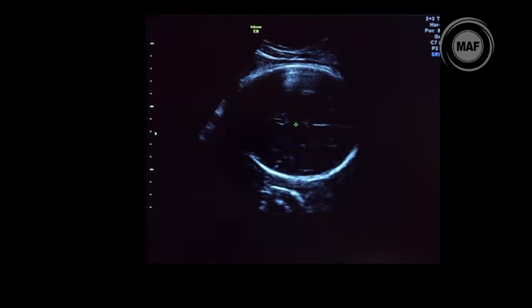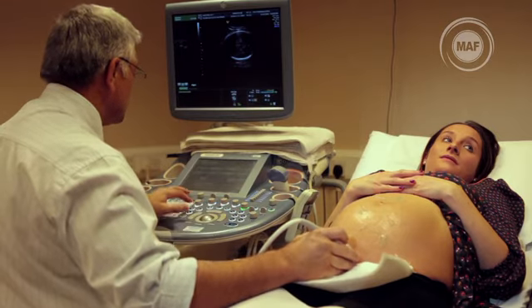It's called the biparietal diameter. So we take the cursor, anchor it, and then bring it over, and on there it tells you how many weeks it is. And it all depends on gestational age, which is right here. It depends on which charts you're using. And then we're going to do the occipitofrontal diameter, that's front to back of the baby's head.